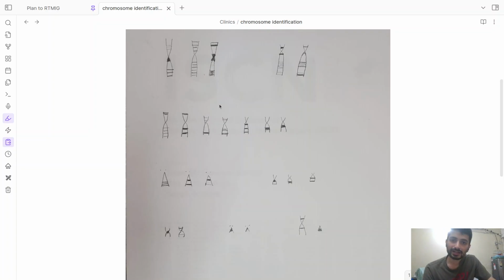So chromosome 8 and 9 are often difficult to differentiate, but what I've noticed is that chromosome 9 tends to have two relatively distinct bands on the P arm, especially when the chromosomes are long, which may fuse to be a single band in the shorter chromosomes when they are stained, and that is what might create difficulty in differentiating these two. But as we'll see the actual metaphases, we'll try to further delineate how to differentiate them.